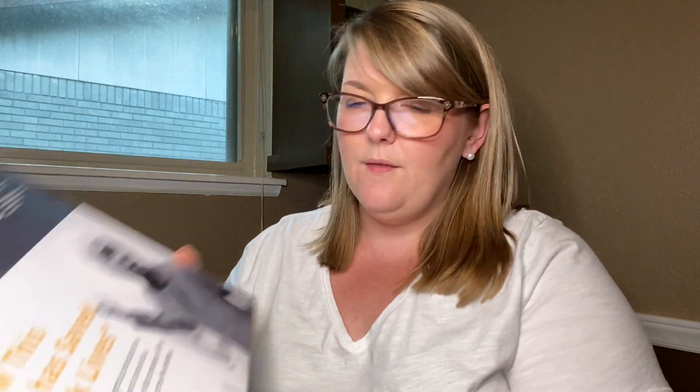The WeightGurus scale measures your weight, BMI, body fat percentage, muscle mass, water weight, bone mass, and then it has a back leg. On the back of the box it says at Greater Goods, we design thoughtful products and attempt to live life thoughtfully in the world around us — and it references greatergoods.com/give. I like companies that do things for a good cause.